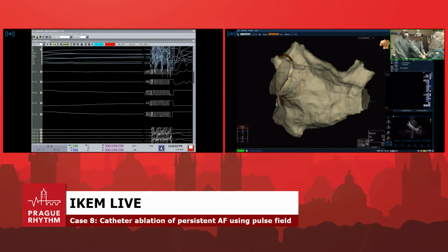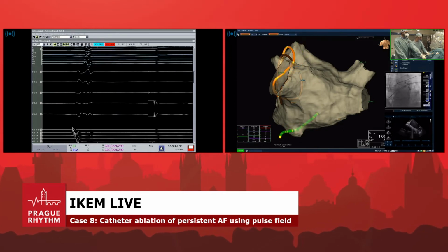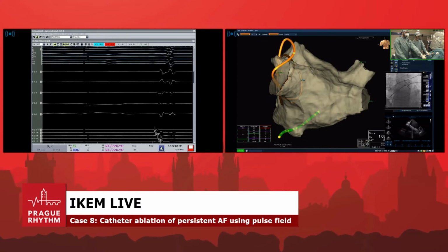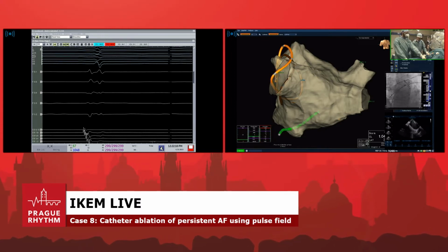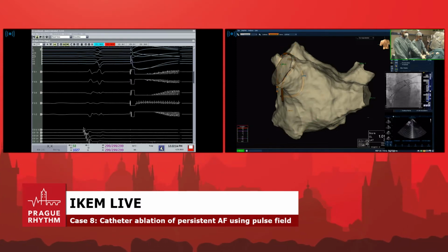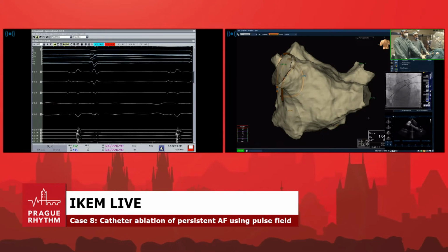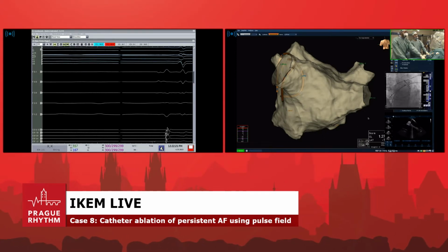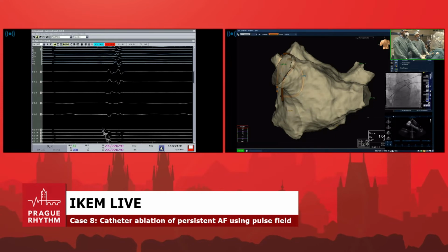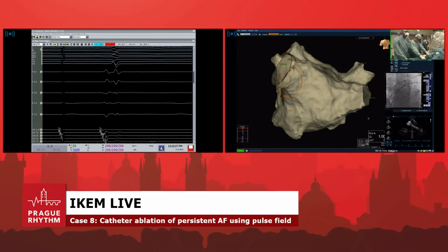For the next set of pulses, I'm coming back also during rotation, but I'm going to do some anterior torque. So I'm counterclocking the sheet. Okay, LSPV, pulse 7. We are really hugging the whole thing, and this is good, because anteriorly you see that the catheter is already inside. LSPV, pulse 8.